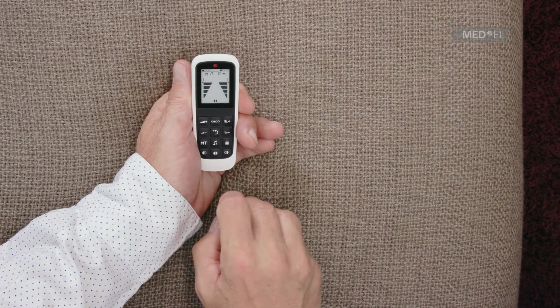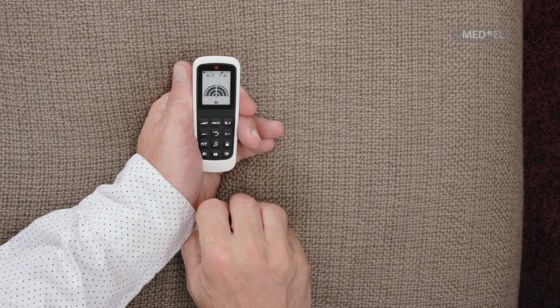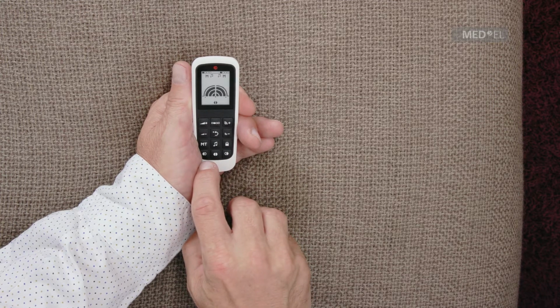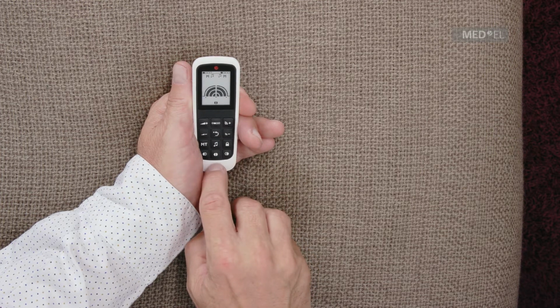To increase the sensitivity of your audio processor's microphones, press the upper sensitivity key. This will increase the range of the microphones, but may also increase levels of background noise. To decrease the sensitivity of your audio processor's microphones, press the lower sensitivity key.